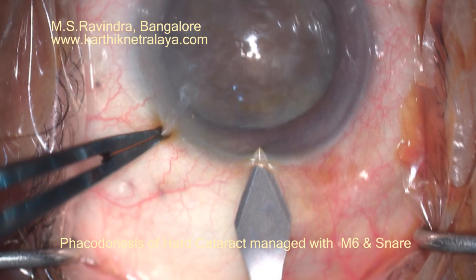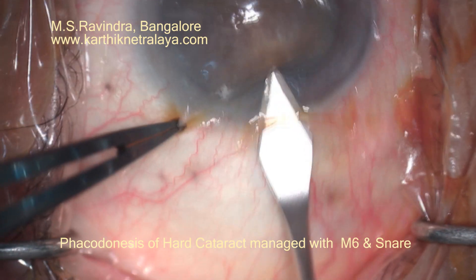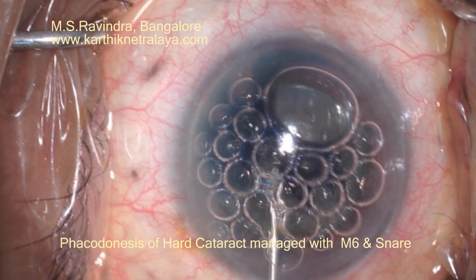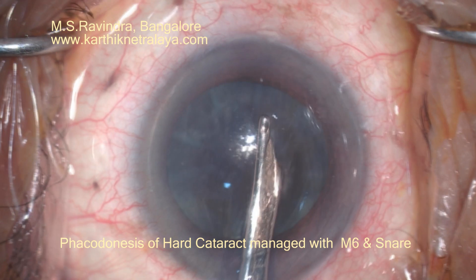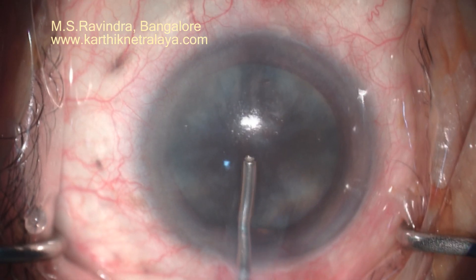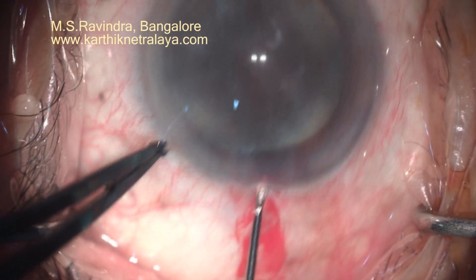An extremely hard large cataract in an elderly gentleman, with topical anesthesia. A 2.8 translimbal keratotomy is made with a small conjunctival flap. Air followed by trypan blue is used. You can see the zonular weakness all around, so I need to be extremely careful with handling the capsular bag and the zonules.